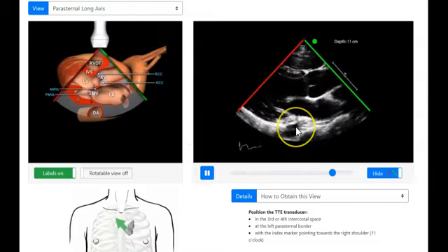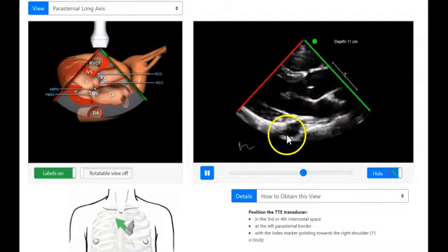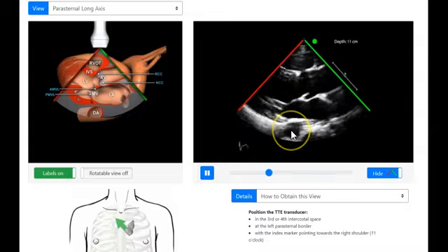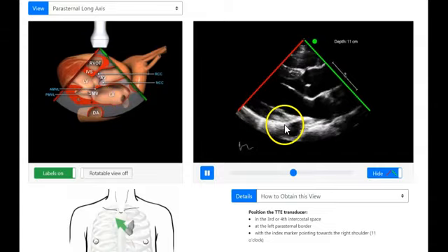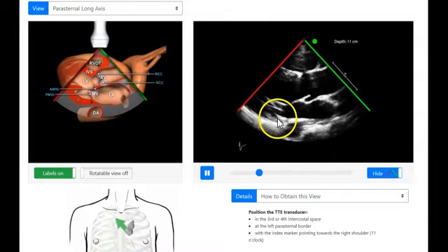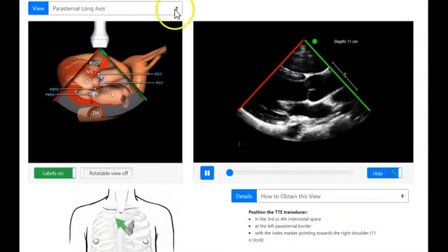So you'll always see this in your image on a patient. It may look a little bit different in different places, but that'll always be there. And you don't want to mistake this for a dilated coronary sinus. A coronary sinus would be up in here, and it would be right in this area here above the pericardium there. That was the parasternal long axis view.